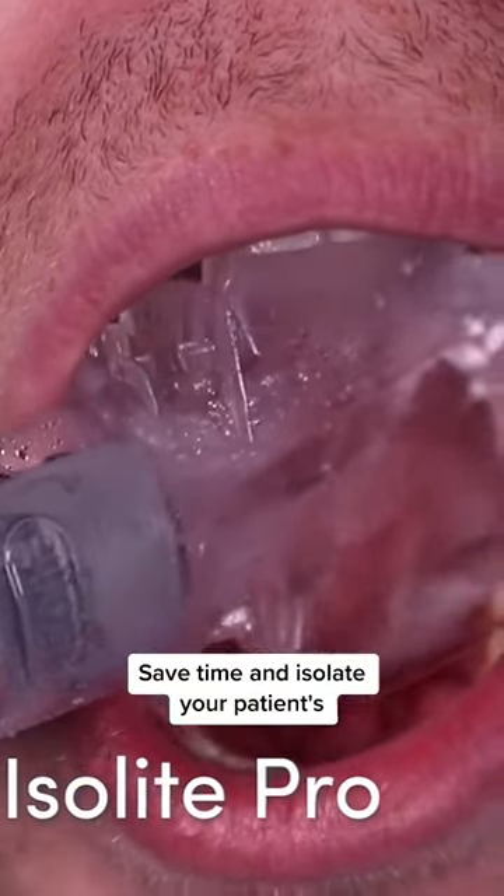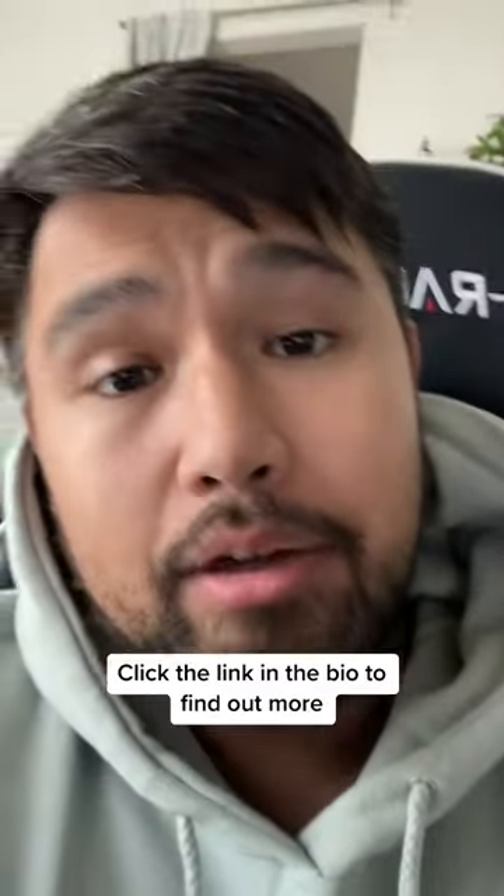Save time and isolate your patient's teeth with the Zyrus Isoli Pro with the posterior mouthpiece. Click the link in the bio to find out more.